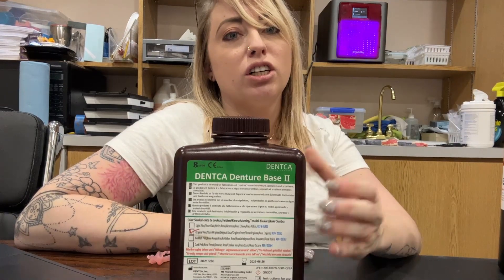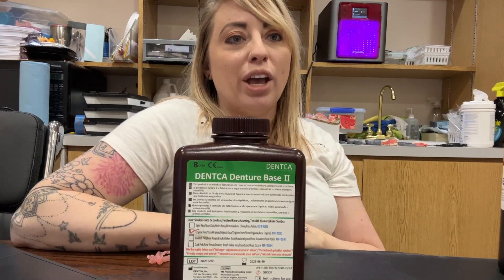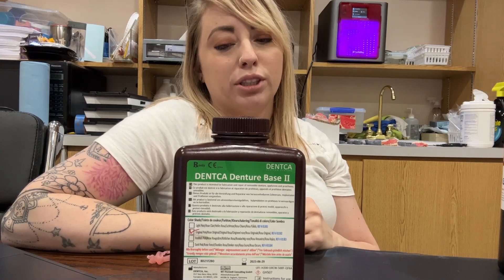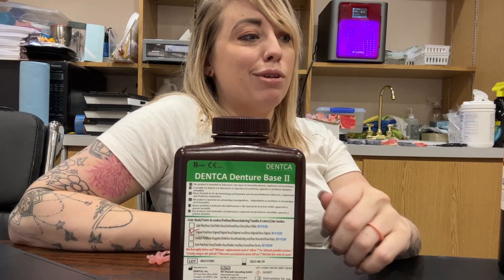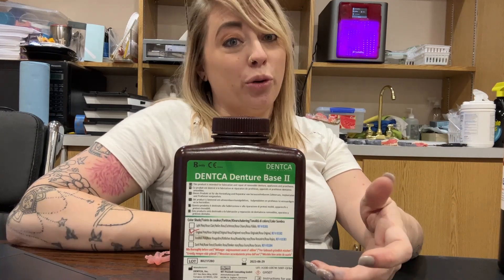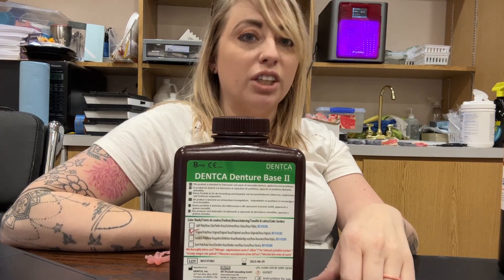Another one we've used in the past is the DENTCA Denture Base II. To be honest, I don't particularly love it. We had it for a long time just because 3D printing is so new and we're limited in the market. It's really brittle. If it's for a temporary or immediate denture that we know we're going to redo, it's not a problem, but this is definitely not my go-to for dentures and partials.